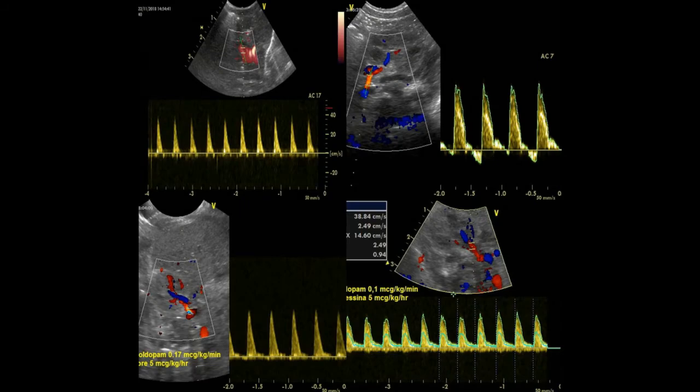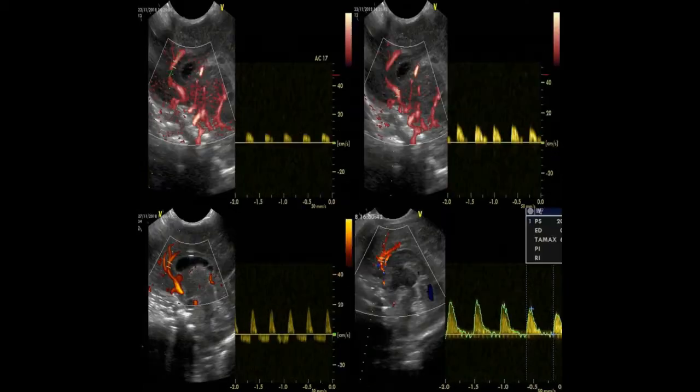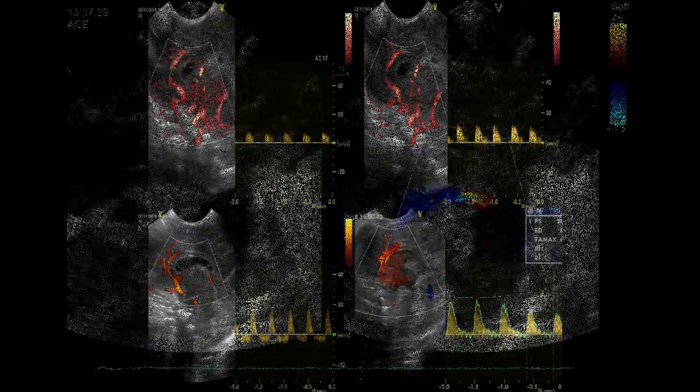Using pulsed wave Doppler, three patterns of diastolic flow can be distinguished: forward, absent, and retrograde flow. A retrograde or absent diastolic flow indicates large ductal steal due to a hemodynamically significant PDA.